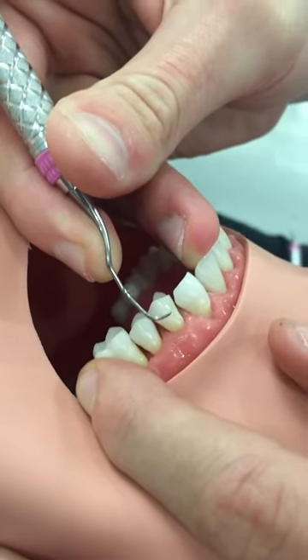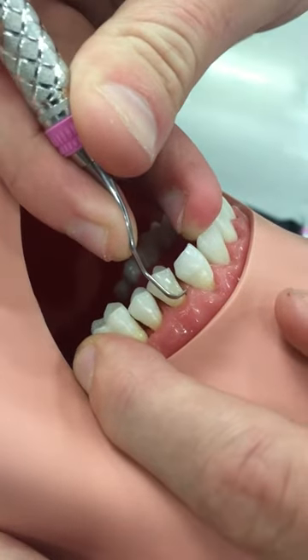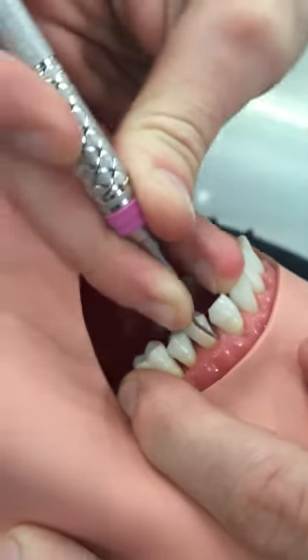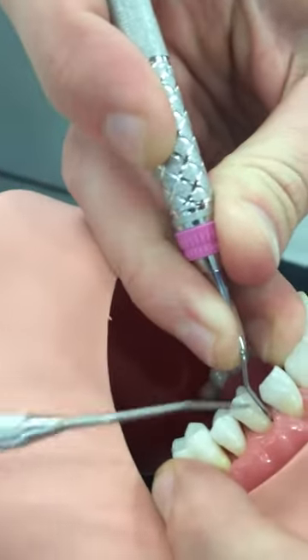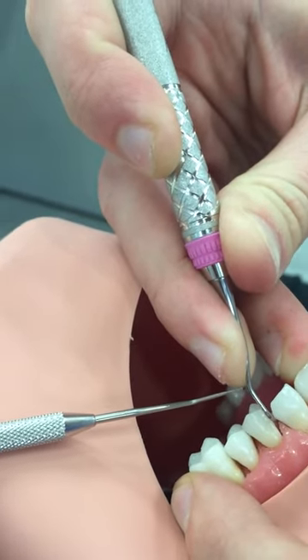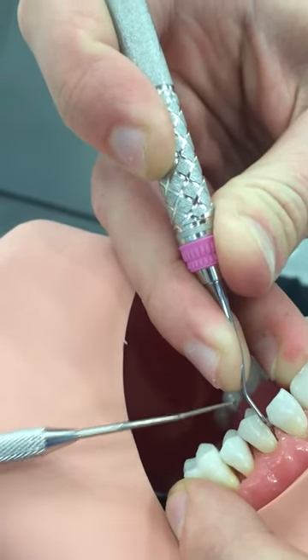The way the trick works is Bryson's going to go ahead on number 12 and he is going to access the mesio-buccal. When he gets the stroke in the correct position, this area right here — this first bend — is always going to be facing the distal.